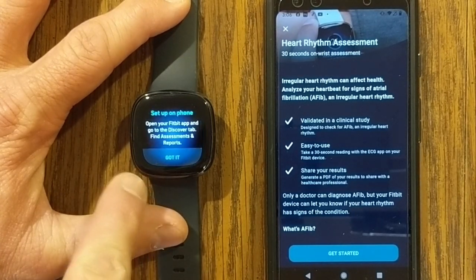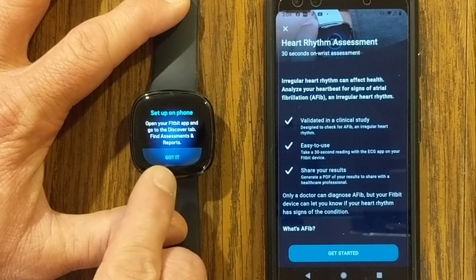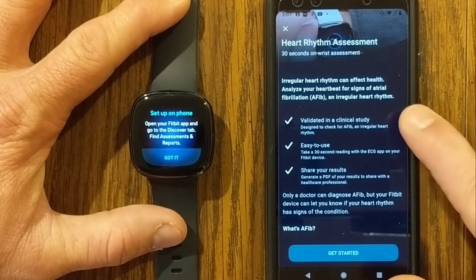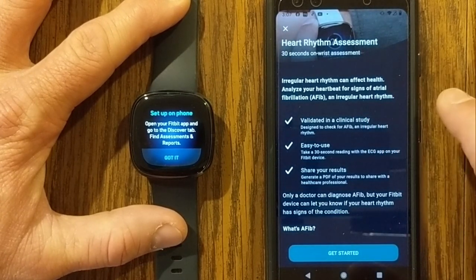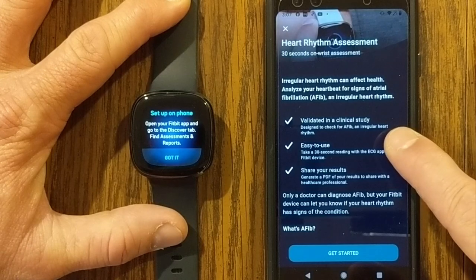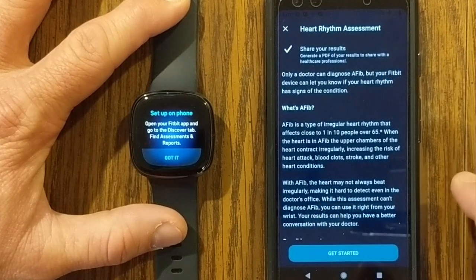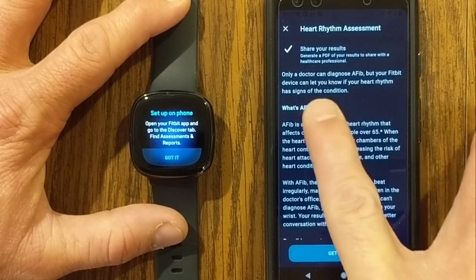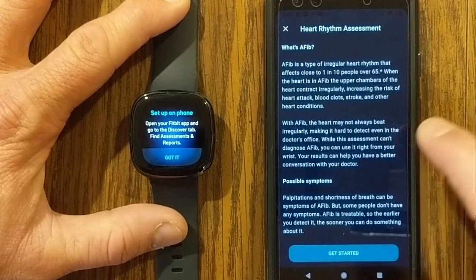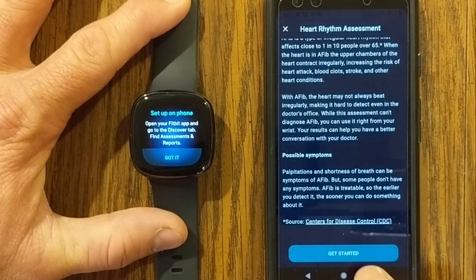Going into that will start it up. It says: set up on your phone, open your Fitbit app, and go to the Discover tab — which we just did. It detects irregular heart rhythm and can affect your health. It'll analyze your heartbeat for signs of atrial fibrillation. This is something you can just use as a tool. Only a doctor can diagnose AFib, but your Fitbit device can let you know if your heart rhythm has signs of a condition. It goes into more detail about what AFib is, possible symptoms, and if you're ready to get started, click Get Started.